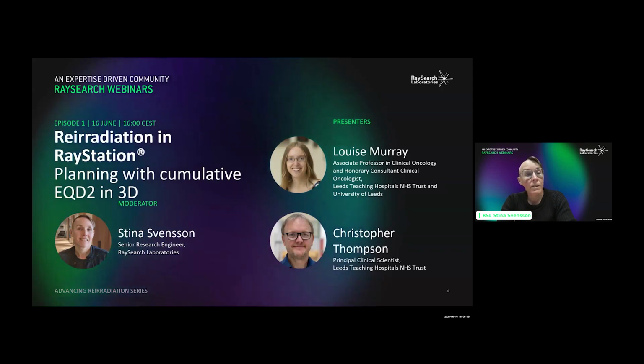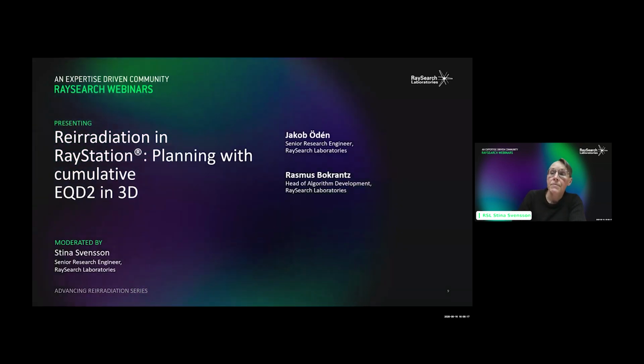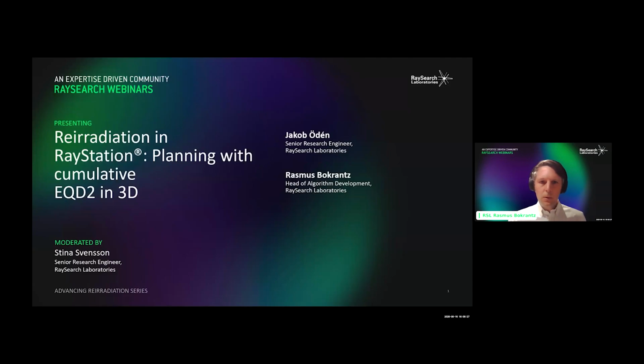Yes, so let's start with the presentation. I leave the floor to RaySearch team, and I think that Rasmus is the first one out. Yes, thank you, Stina. So please share my screen.